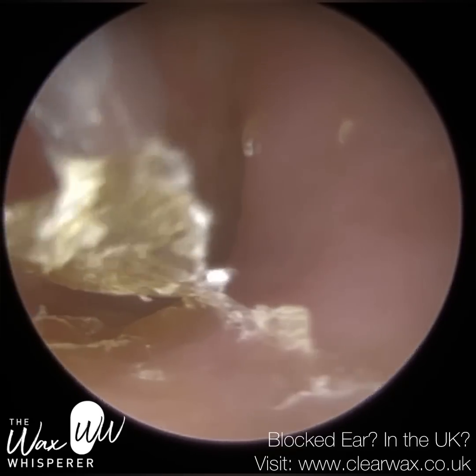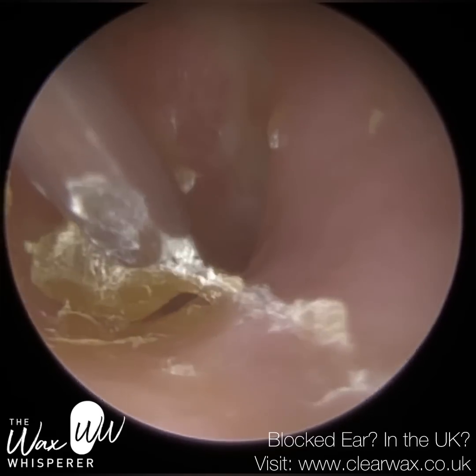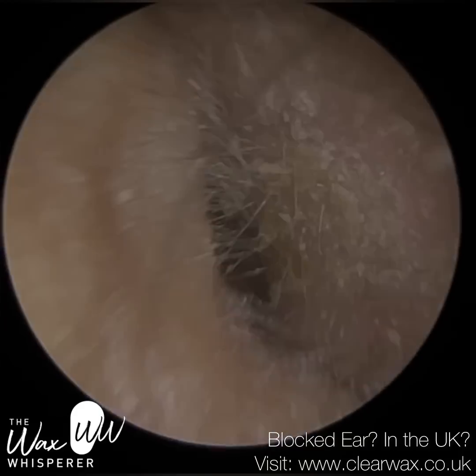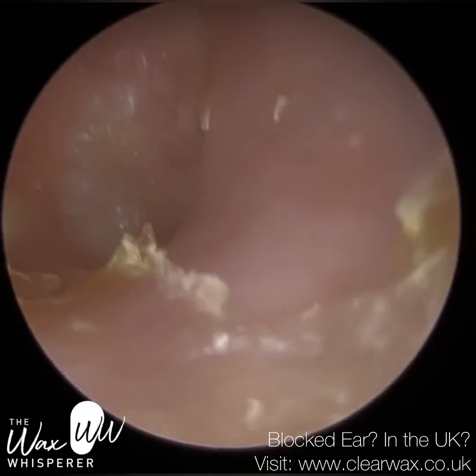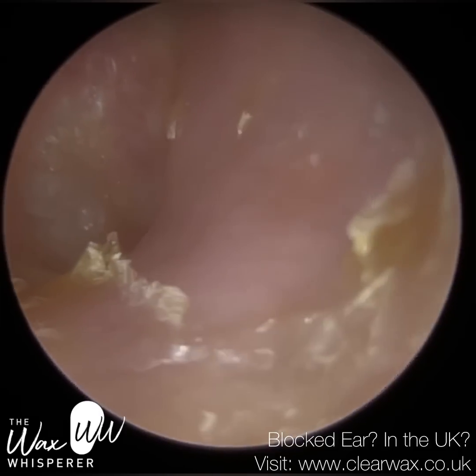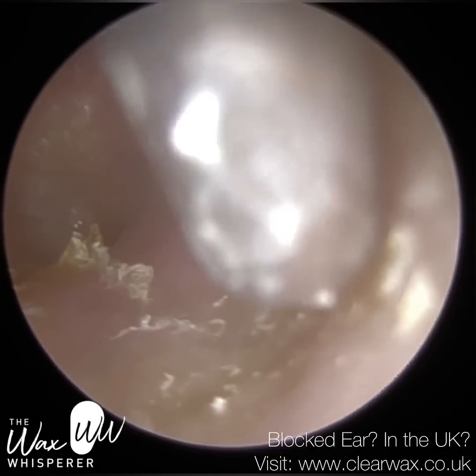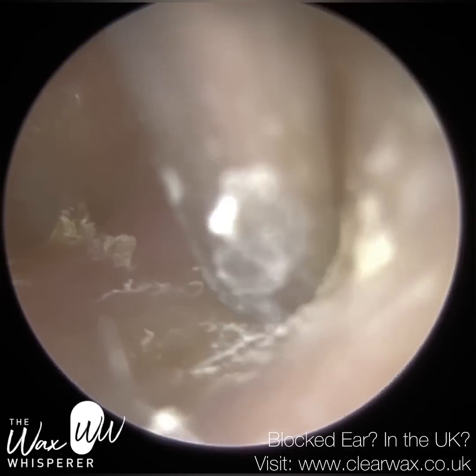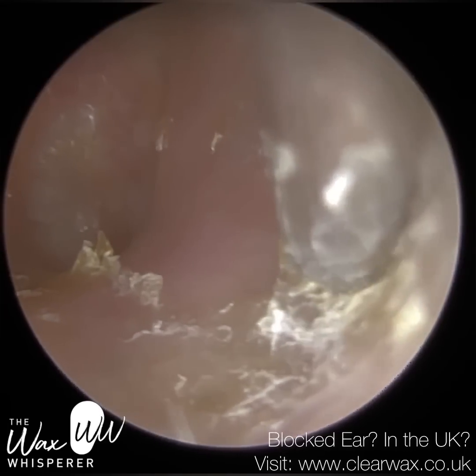But you can see we did a pretty good job. I'm pretty pleased with that. There's no bruising or hematoma there, or any abrasion caused. Obviously, we don't want to cause any micro abrasions, because that's just going to possibly lead to an infection as well. So just some crusted skin here. Again, I'm gliding across the surface only.